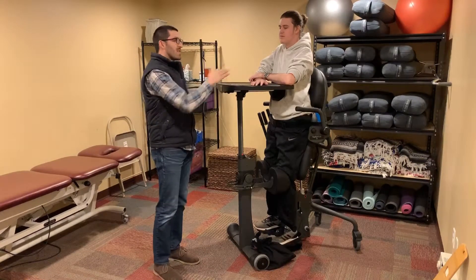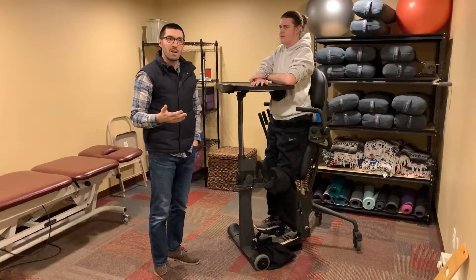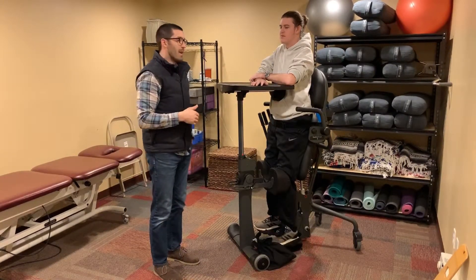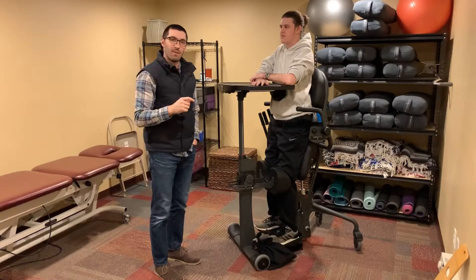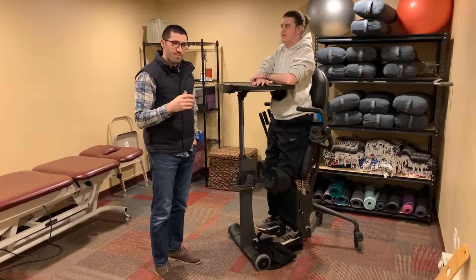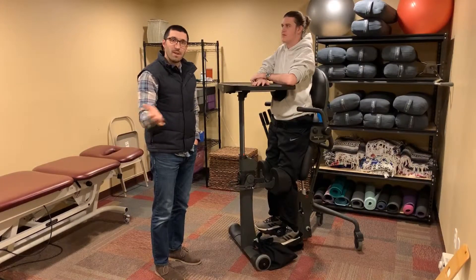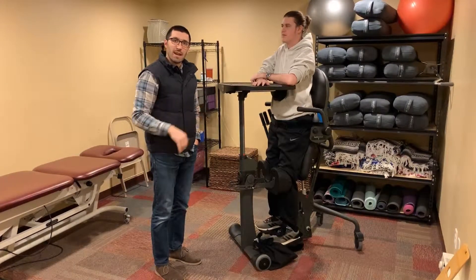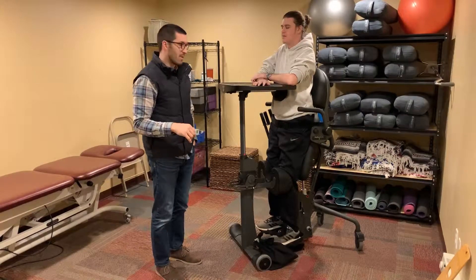In Trev's case, he has a C4 level spinal cord injury, has a little bit of sensation below his level of injury, but it was mostly a dependent transfer into the standing frame itself.